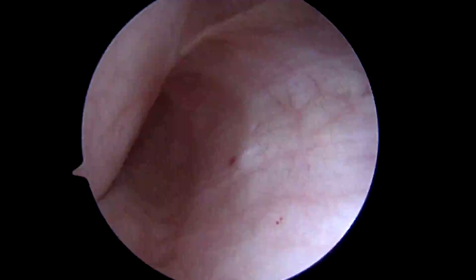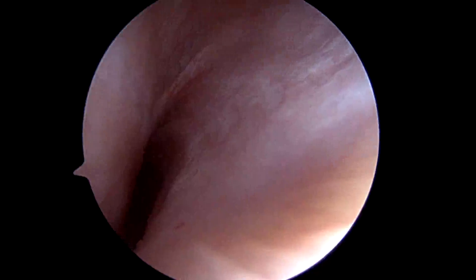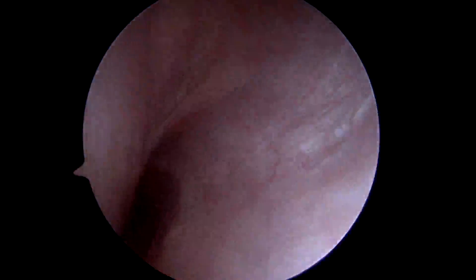The medial gutter — this is pretty clear. We'll take care of that in a minute; we're going to go around to the lateral gutter next.